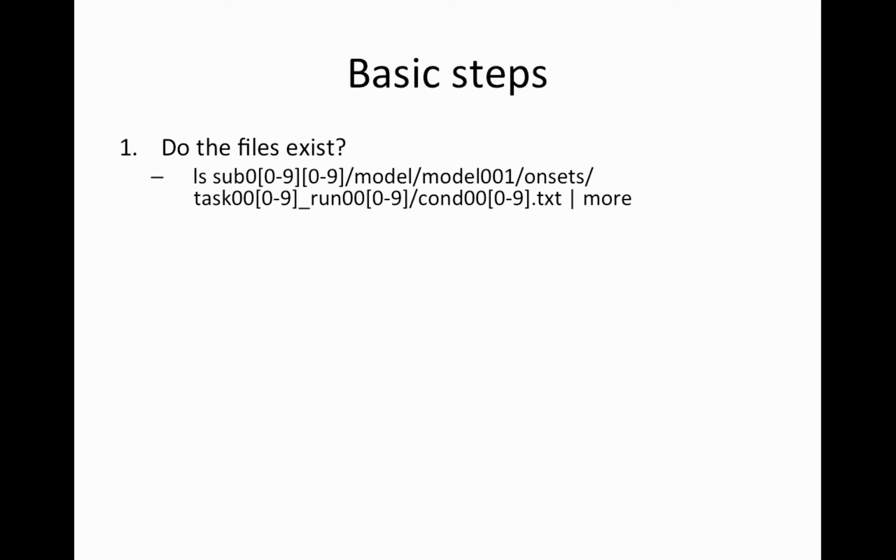Okay, so the first step is to make sure all your files exist. This is an example of the type of command I use in Linux to look for all my files. So here I'm looking for the onset files, which I'll show you in a second. They're stored in a subject file. Here, let me just show you one.